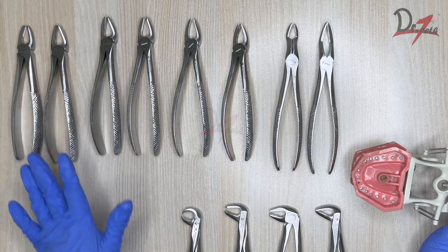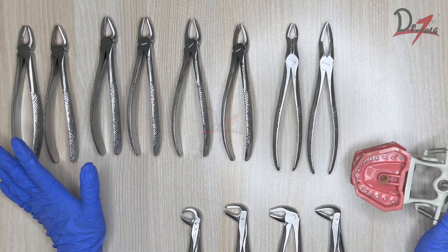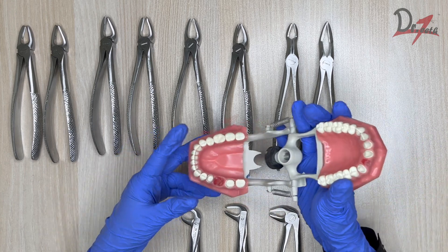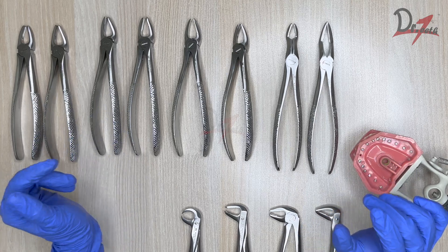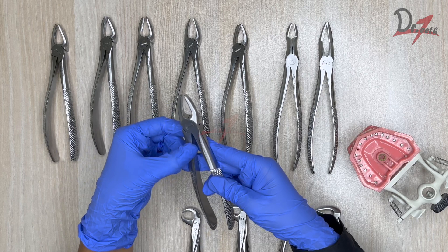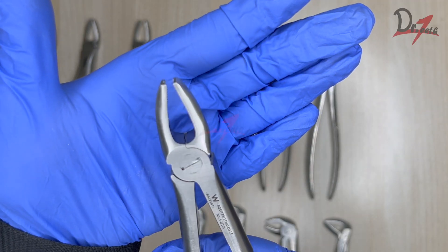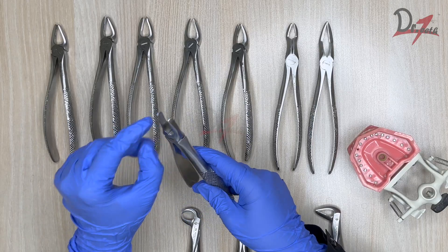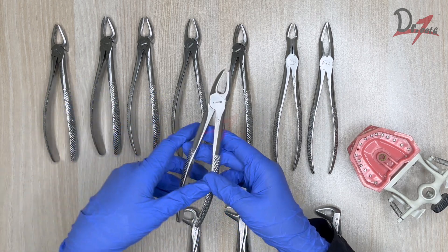Here are all the upper forceps and here are the lower forceps — you can see the basic design difference we discussed to differentiate upper from lower. We also have a typodont on which we will demonstrate how to extract teeth and what movements we make. If you look closely, Valdent has mentioned the numbering of each forcep and what tooth it is used for, but there is no need to remember these numbers — you can look at the design of the beaks to determine which is suitable for which extraction.